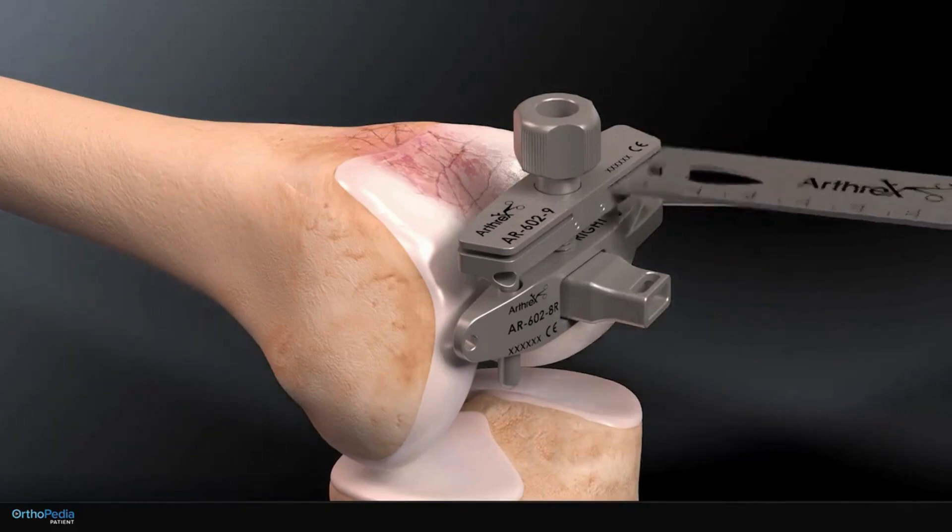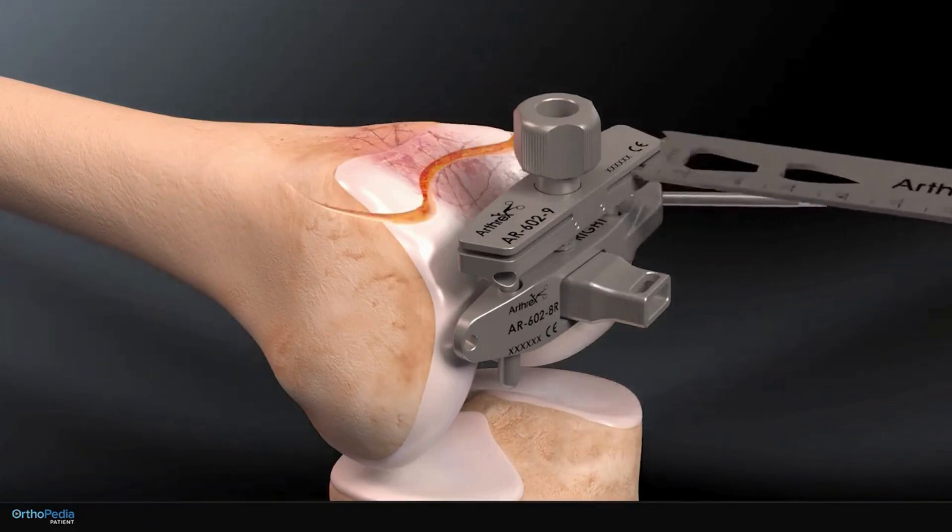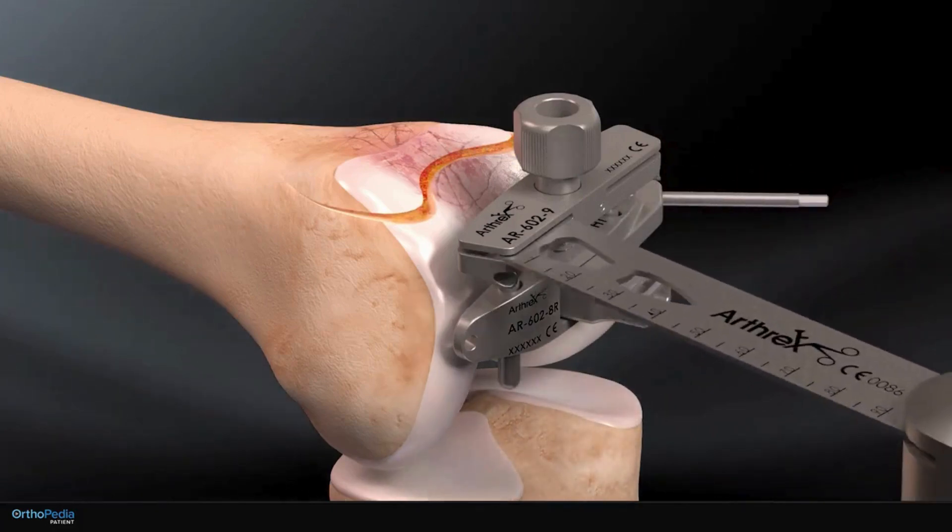A cutting guide is attached to the base and used to determine the correct level of bone to be removed. A bone saw is inserted through the guide and used to remove the top section of the front of the thigh bone that contacts the kneecap.